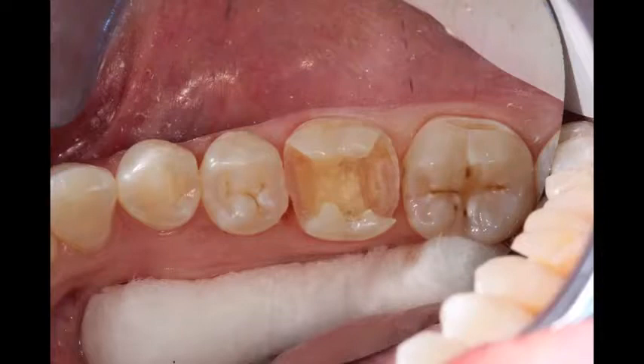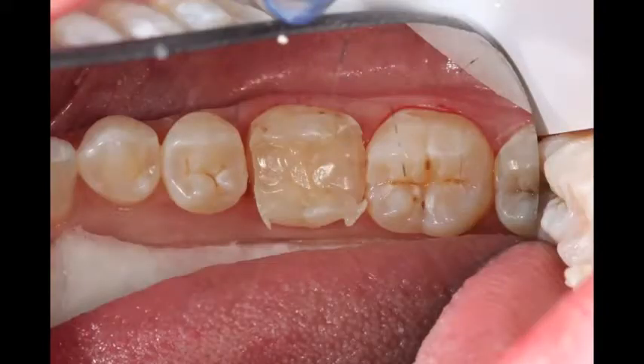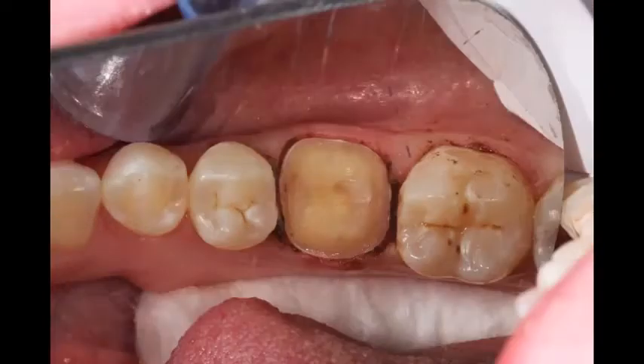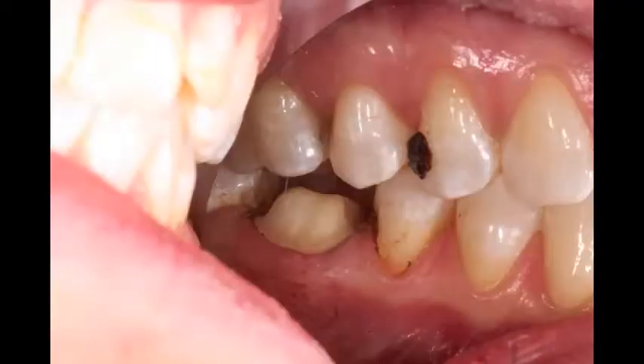Moving along clinically, we'll place a disposable matrix band around that tooth and use composite as our buildup material. The tooth is then prepped just the way I explained, and then the intrasulcular paste is put in there along with a copper cap. The patient bites down on that cap for two minutes. Afterwards, we rinse it off, and as you can see in that photograph, we have a very nice prep — you can see the gum line has been retracted away, and we're going to get a very nice impression out of that.